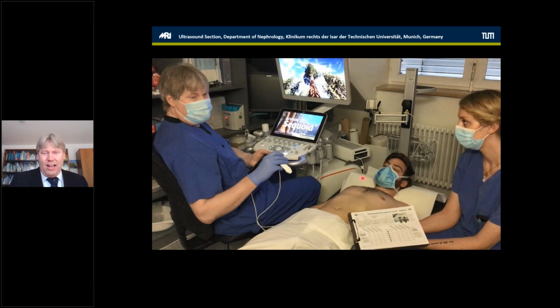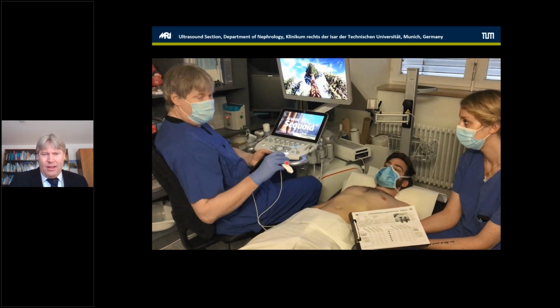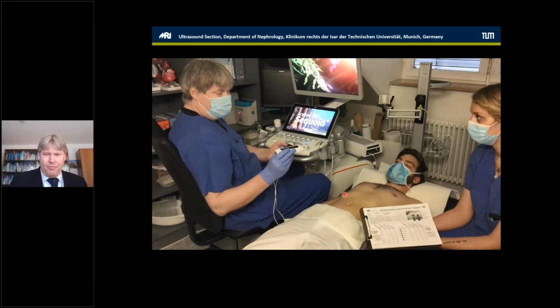All right. Okay. What I was telling was that if you're scanning with the portable devices, there's a big problem that we sometimes are not able to separate one region from each other by a description that can be inserted with a text marker. And what we do is we just store two black images between every region, so we can separate it and we can post-analyze it, which is quite helpful if we are writing our report right after the exam.